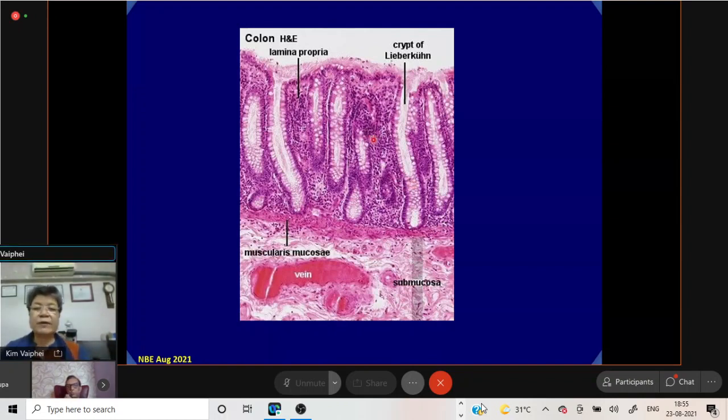And that's why that 5 per 100 and 20 per 100 ratio was coming up. And inflammatory cells, again, in the lamina propria are present. So this is a properly oriented colonic biopsy where full-length crypt could be seen, and the surface epithelium is the epithelium between the two crypts. So the crypt epithelium and the surface epithelium should not be clubbed together.